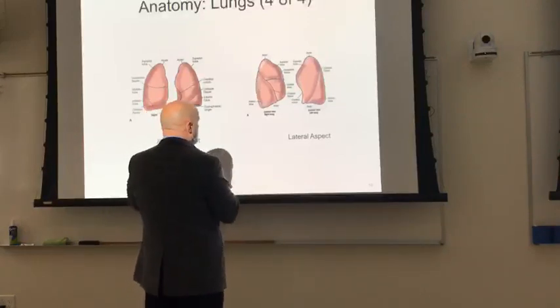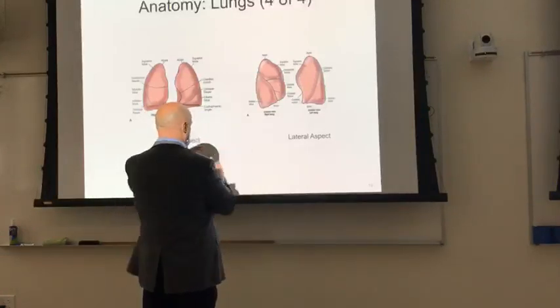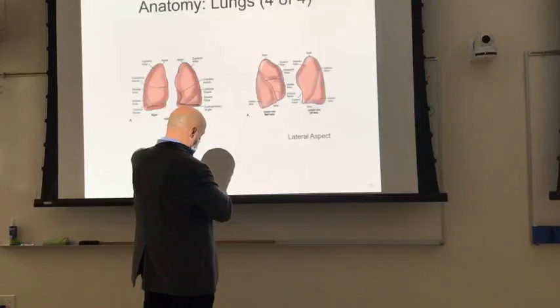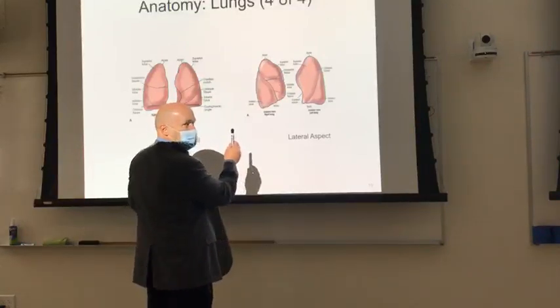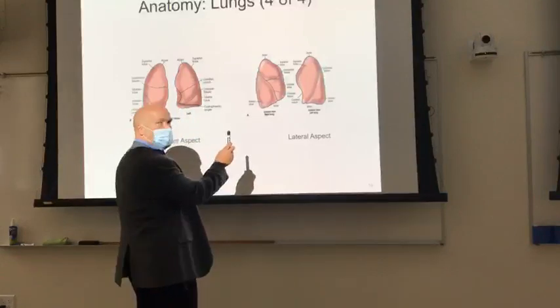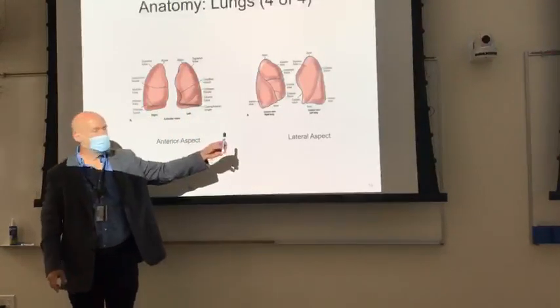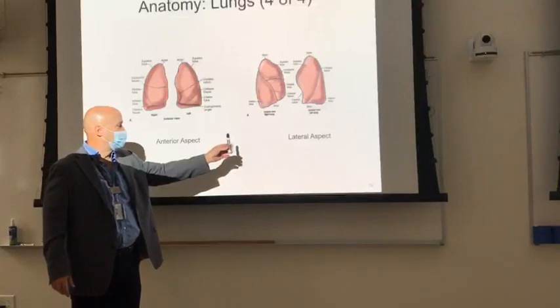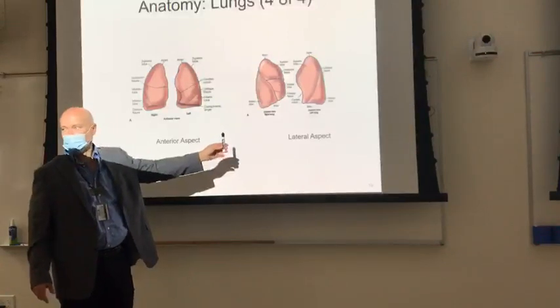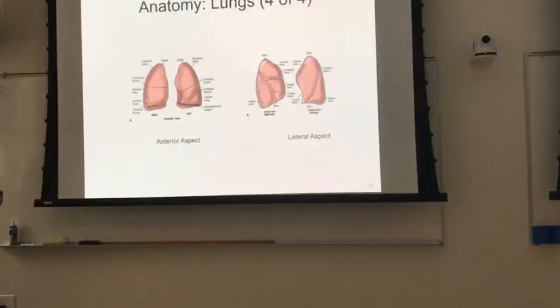So, in some cases, the pin's on there securely. Okay, so if I pull it apart a little bit, I can see that there's some sort of funny abnormality there, right? But I can't really tell what that abnormality is until I get two views. Can y'all see okay over here? So with the pin in one projection, you can't really see much, but in the opposite projection, you can see a little bit of a distortion.